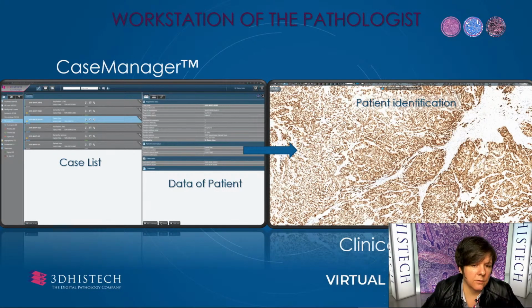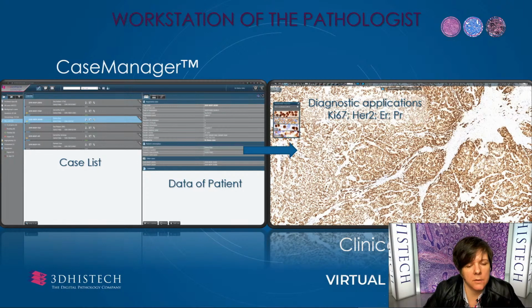This is how the workstation of the pathologist looks like. The left side shows the case manager's user interface, which has three parts: the case management part, the list of the selected cases, and the details of one case. The right side of the window is the diagnostic clinical viewer. In order to avoid case mixing errors, the diagnostic viewer can visualize only the slides of the currently viewed case.